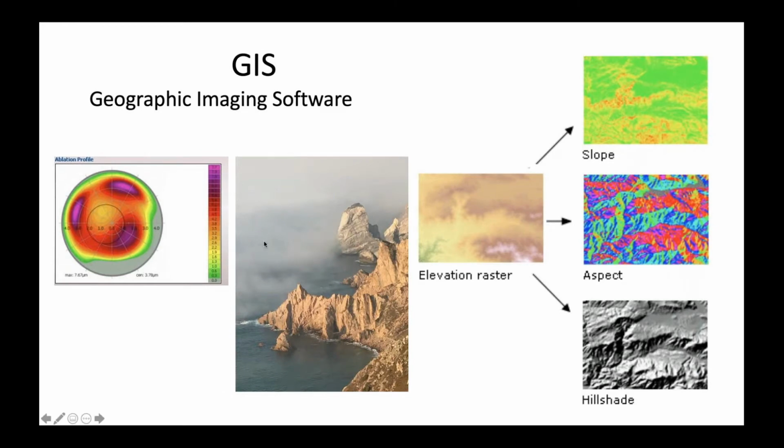And I said, we're dealing with topography. So how does the real world deal with topography? In the real world, there's mountain ranges, there's all sorts of very complex three-dimensional topographical features. And oftentimes these three-dimensional topographic features are represented by two-dimensional maps. And it just happens that in the last decade, GIS software, or geographic imaging software, has been designed that pulls all sorts of technical information about complex three-dimensional structures from two-dimensional maps.